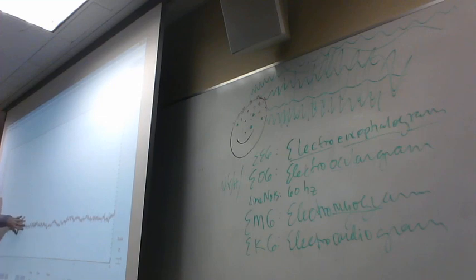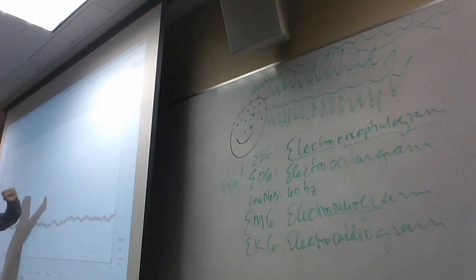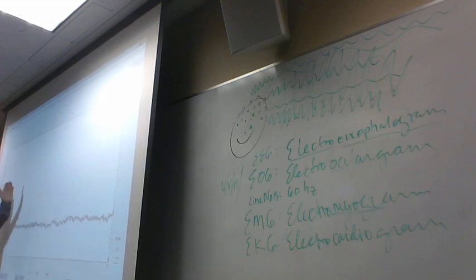Remember we talked about what an epoch was? Yeah, it's just a time period. So if you talk about the Middle Ages of history, that was an epoch of time. Your freshman year is an epoch of time. Our epochs are going to be 1.5 seconds. Okay, so every single one of these epochs represents a different period of time. And what you want to do is slice the pie.